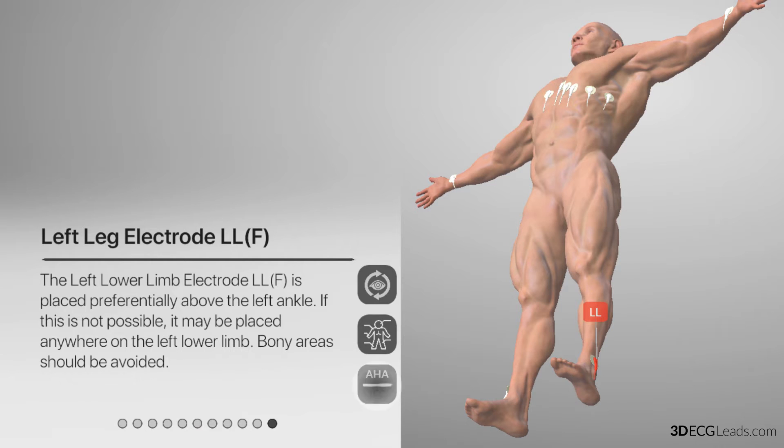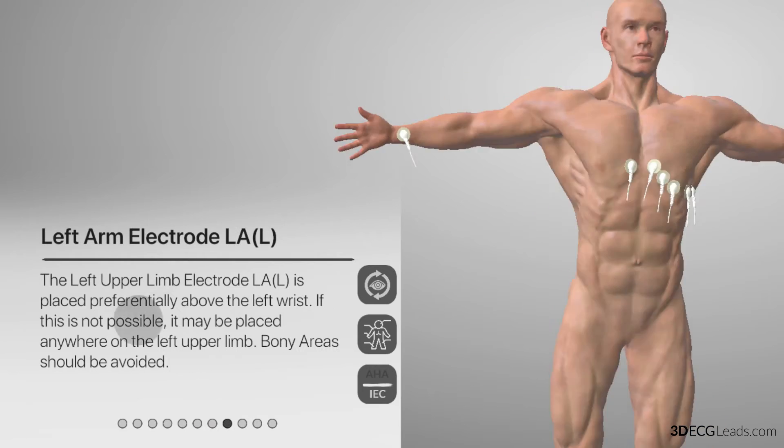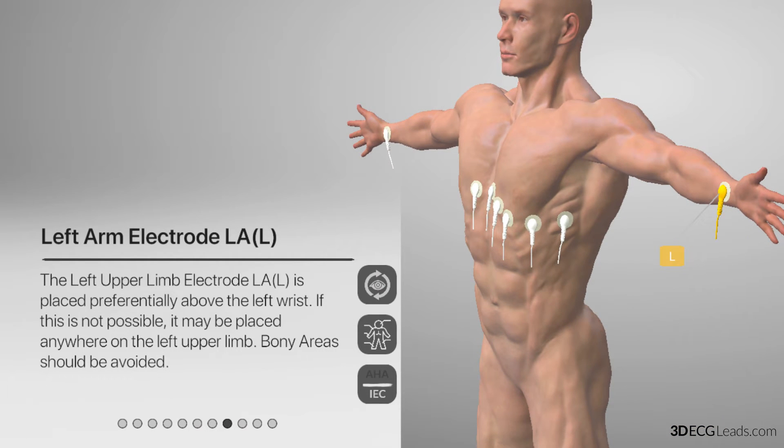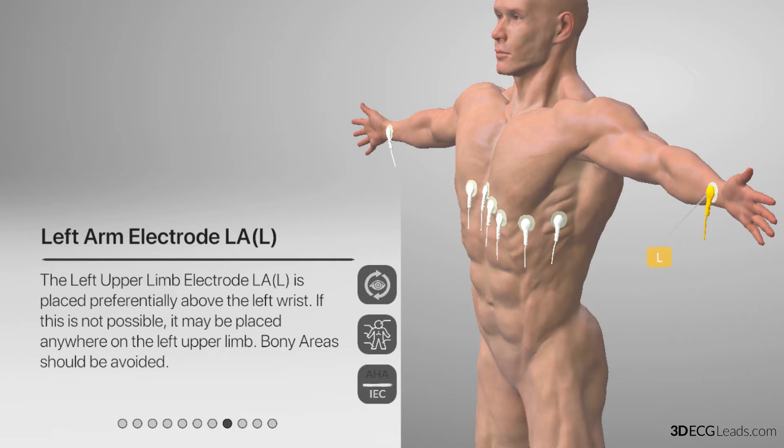Now let us switch the color coding system from the AHA to the IEC. What you will see now is that they are all positioned in the same place as described earlier, but the colors have changed, as well as the naming of the leads.